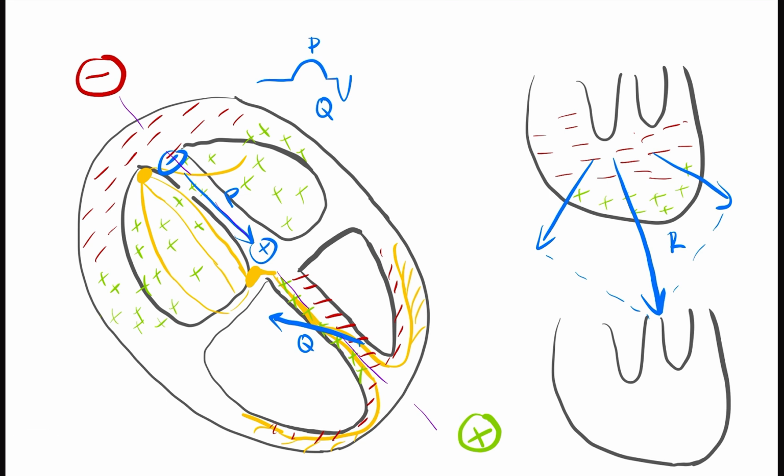So we've got PQ, RS. QRS complex means depolarization of the ventricles, but what we have to keep in mind is that the repolarization of atria is still happening here. It's just not visible in the ECG waves, because it's smaller compared to depolarization of ventricles, because they have more muscle mass, therefore it's bigger.